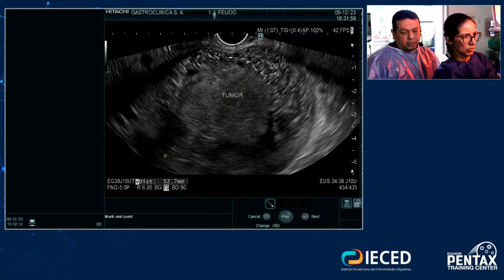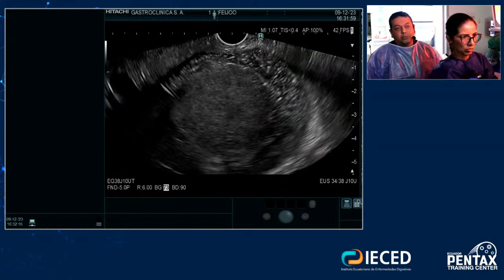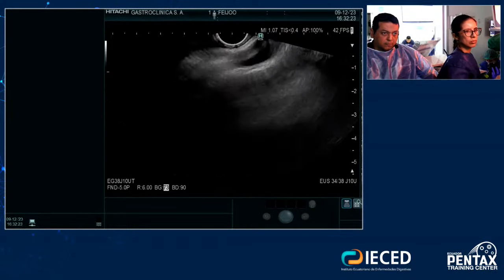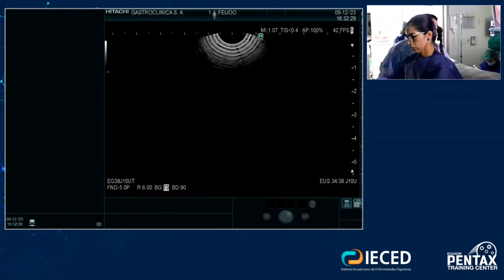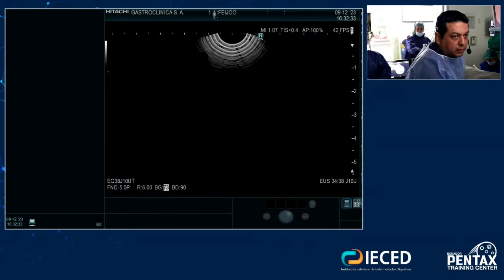I will show you the shear wave of the lesion.